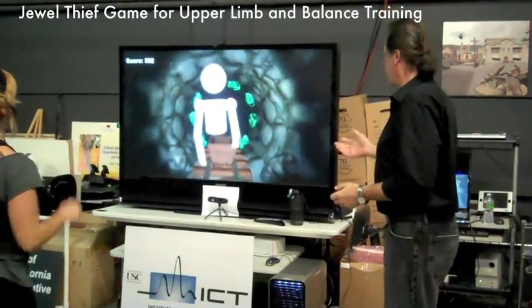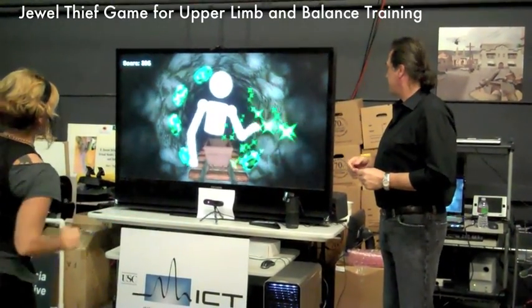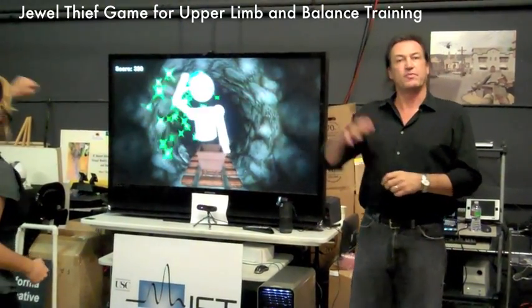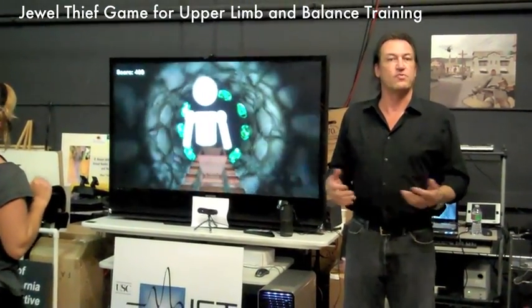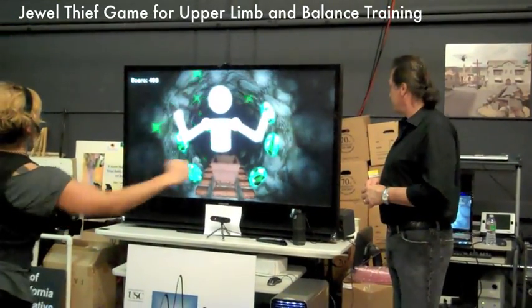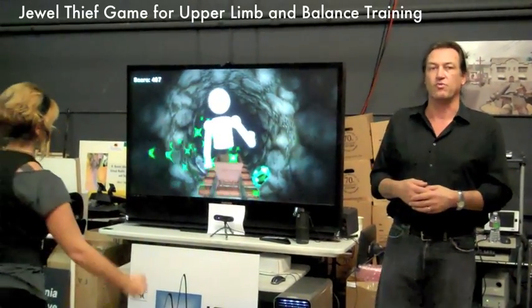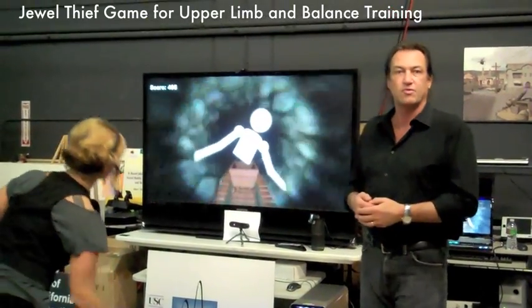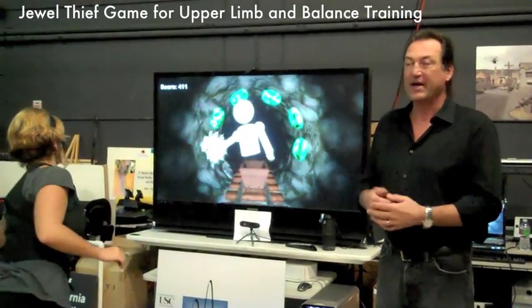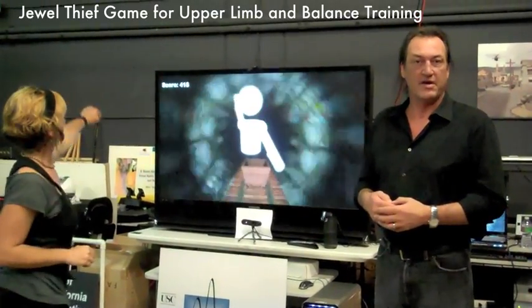Another example using the PrimeSense camera to track user movement is with this particular game called Jewel Thief. This is a game devised for helping people to interact with their upper extremities for reaching range of motion and so forth. As the user moves, they can interact with objects in a natural way — again, not wearing any encumbering wires, markers, or LED lights. This is really the future of motor rehabilitation and will significantly drive how users interact with digital content in a variety of ways.